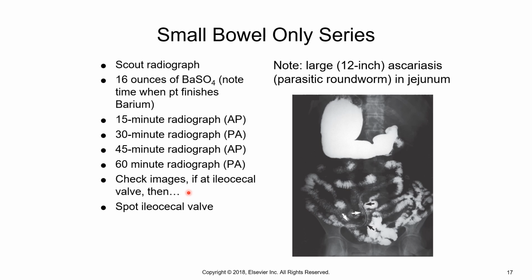would actually look like, oh, let me find this. I don't know why this particular book, they made it so crazy. The spot image of the ileocecal valve is all the way back on 504, figure 13.16. They show you an amazing spot image that D is the terminal ileum in that picture, E is the ileocecal valve, and then they label the cecum.